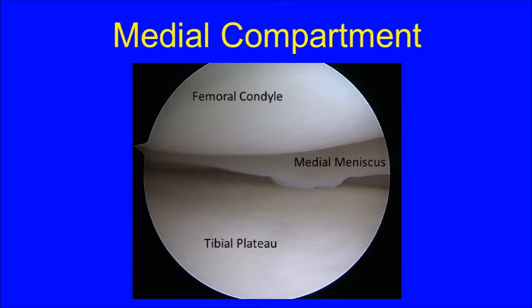For orientation purposes, when the arthroscope is placed into the medial compartment of the knee, the femoral condyle is seen on the top of the monitor, the tibial plateau is seen at the bottom of the monitor, and the medial meniscus sits between these two structures in the middle.